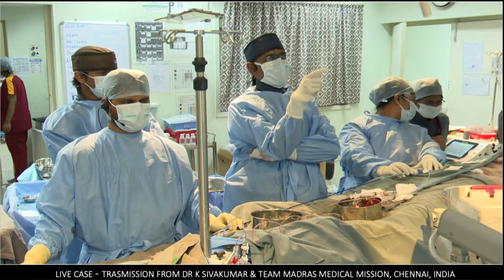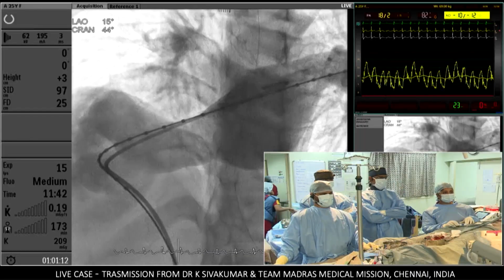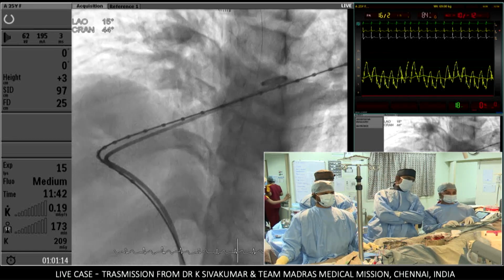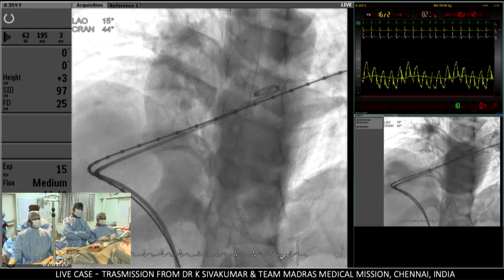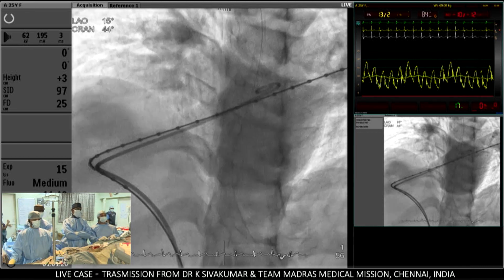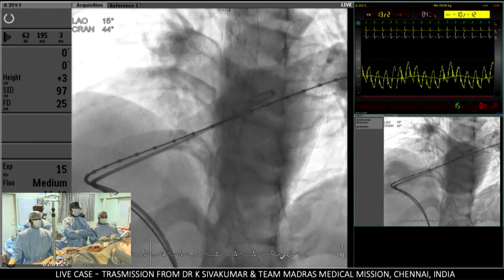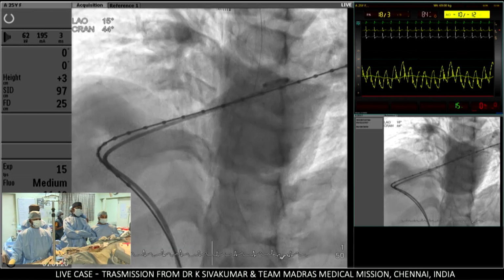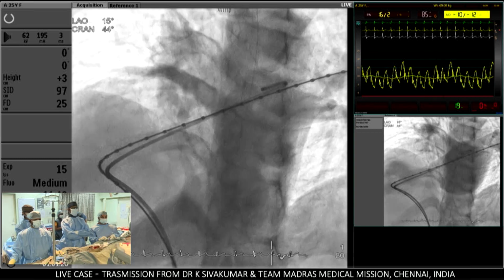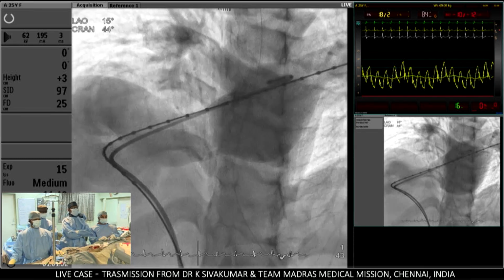What I will now show you is the angiography. Show the first picture. So this is the first angiography that we did today. I pointed out previously in the PowerPoint, this is a patient who is having a dextroposed heart. So this dextroposed heart is making the right ventricle come on the right side of the sternum and the main pulmonary artery come on the left side of the sternum. And so this is almost in a very shallow LAO cranial view.